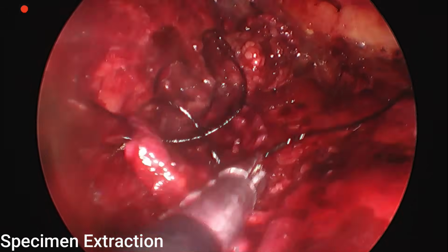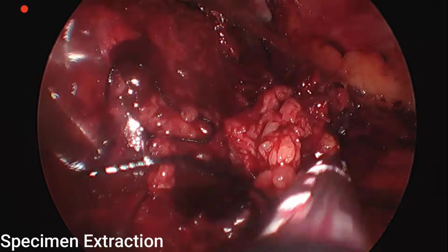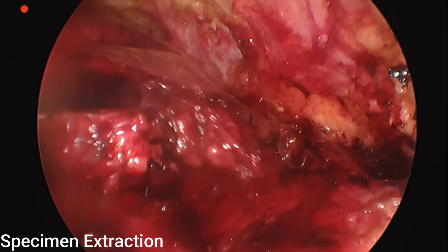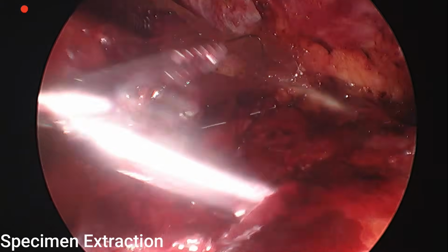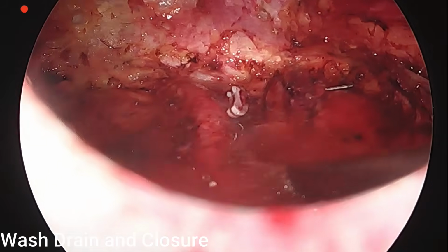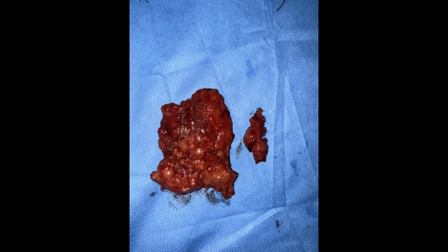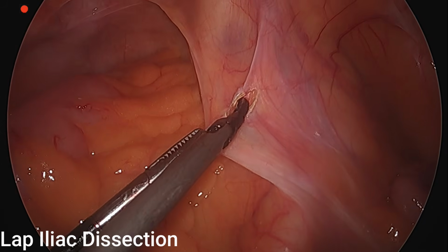Once this is done, the entire specimen is placed in the endo bag and the specimen is extracted via the 10 mm port. After specimen extraction, we place the ports back again and give a complete wash, and under vision, two drains are placed through each 5 mm port, and that's how the closure looks, and that's the specimen of the inguinal block dissection. Then we proceed with the laparoscopic iliac block dissection in the same position.